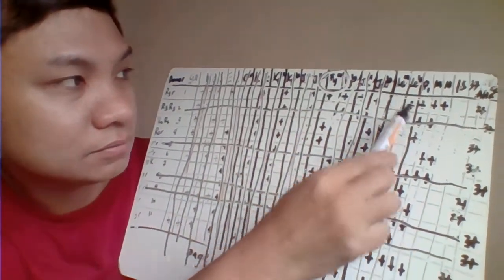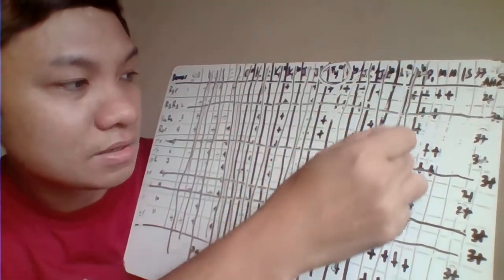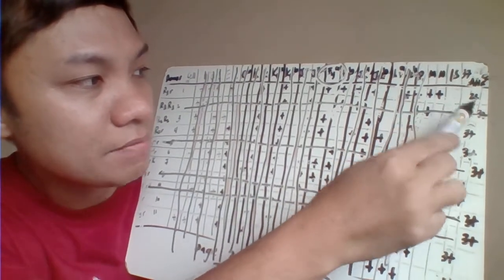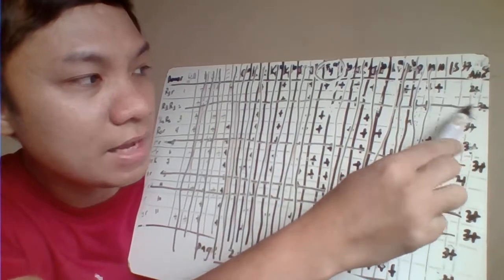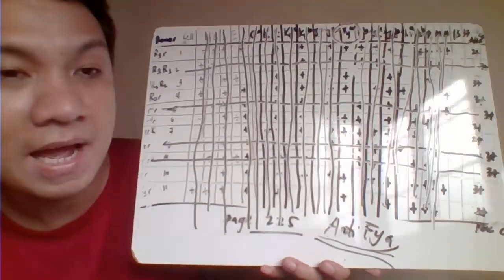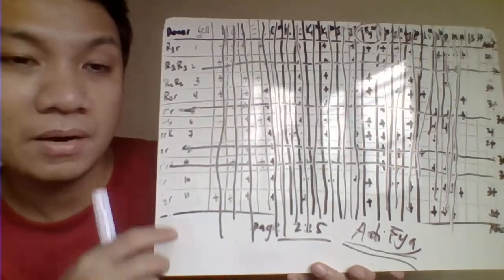Okay, hindi ikaw. So ito negative na siya agad. Hindi din ito. Ito positive. Negative. Positive. Ay, sorry, hindi din siya. Dito, positive. Positive. Negative. Ay, positive siya. Hindi. Okay, positive, positive, yes. Positive, negative, ay positive siya, hindi. Okay, positive, negative, positive, ay negative siya, hindi din siya. Okay, so ang patient natin may anti-FYA na antibody kasi, as what we have here, obtained with our exclusion.